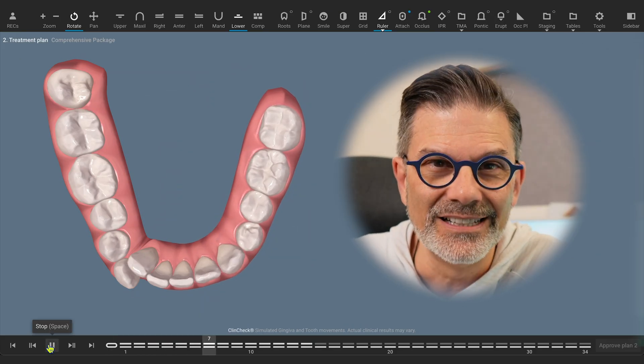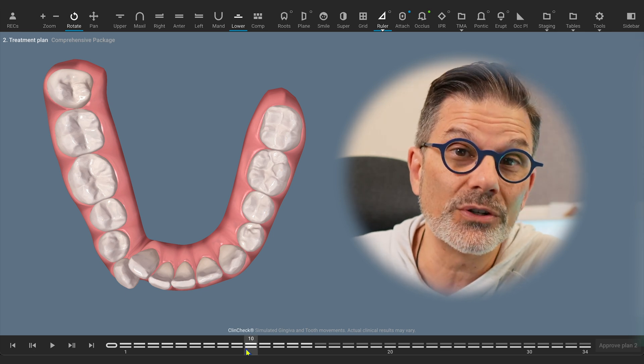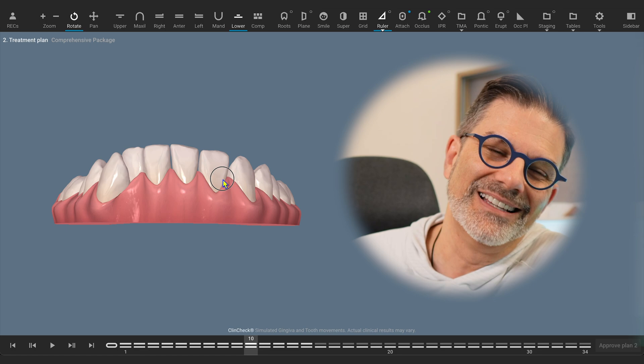I know it's counterintuitive because after more than two decades using clear aligners in my practice, after more than two decades looking at ClinChecks, I still get caught into it. I have to remind myself that what I'm looking at on the screen is not teeth that are moving — it's how the aligner will be shaped, it's how the force will be applied on the teeth. So if we're looking at the shapes of aligners, if we're looking at how the force will be applied, what does that mean? If I look at a ClinCheck and I look at stage number 10, it tells me what the shape of aligner 10 will be and how the force will be applied on the teeth at aligner 10. So let's jump now into the ClinCheck.